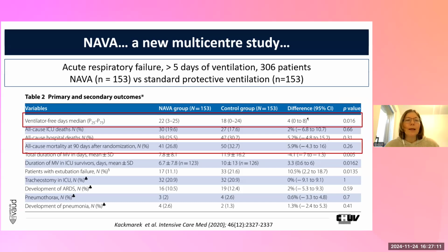More recently, we have had a new multicenter study on NAVA. This time, it's not the same patients. It's patients who were already ventilated during 5 days, more than 300 patients. And we have NAVA compared to standard protective ventilation. This is a randomized study.